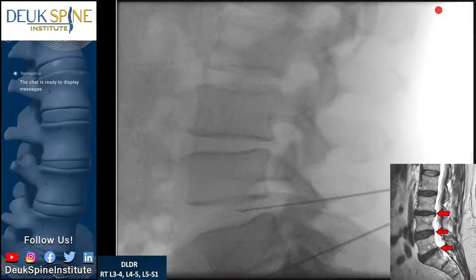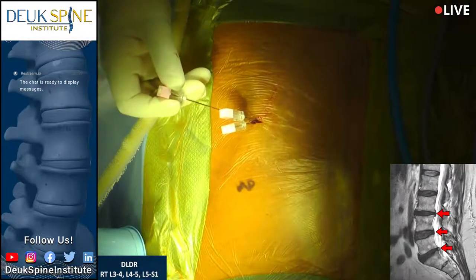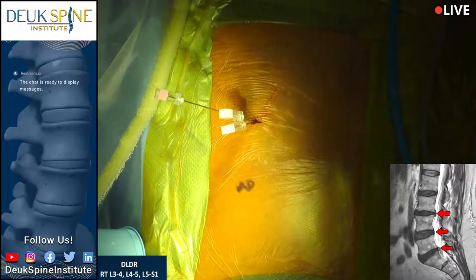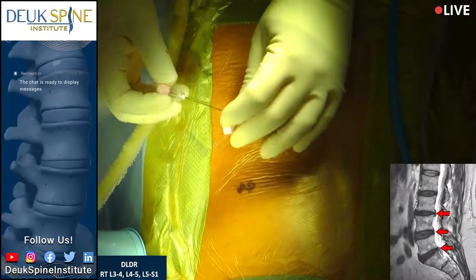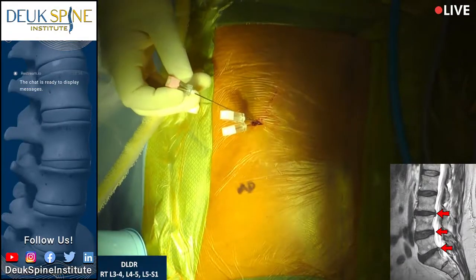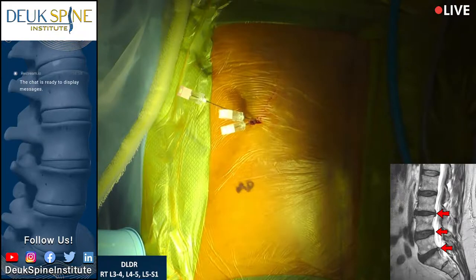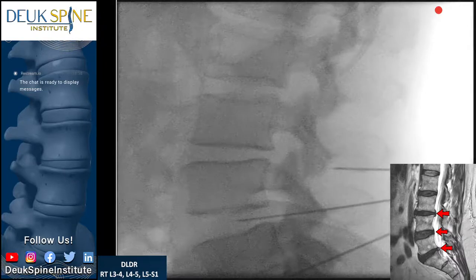All right, we're going to try to do all three discs through one 7mm incision. It's always better if you do fewer incisions. Sometimes we can do it, sometimes we cannot. We're going to try. All right. So I just got to kind of jockey the needle. Patient's very comfortable. He's sleeping, which is fine for right now. I feel comfortable with where we are.